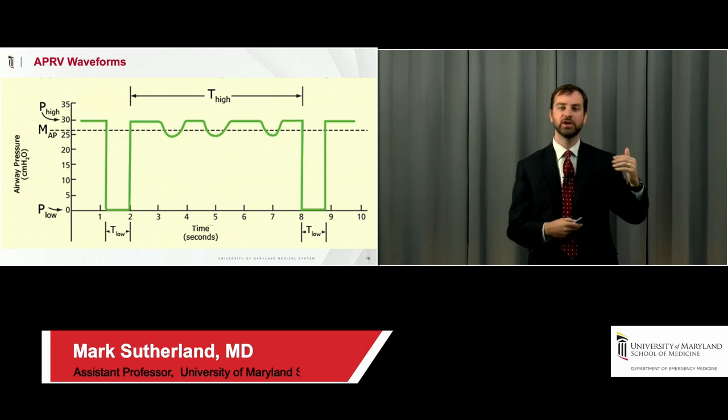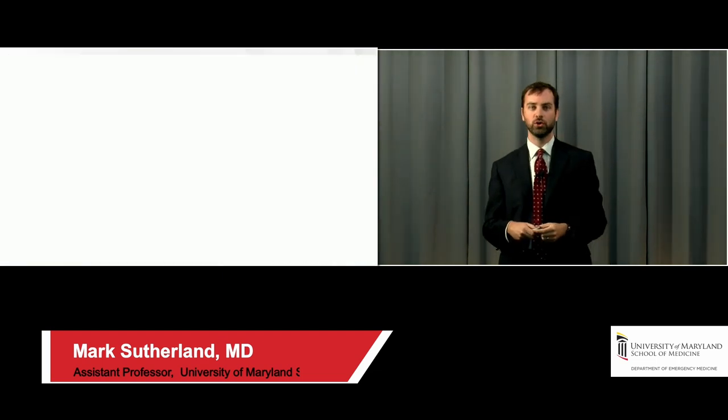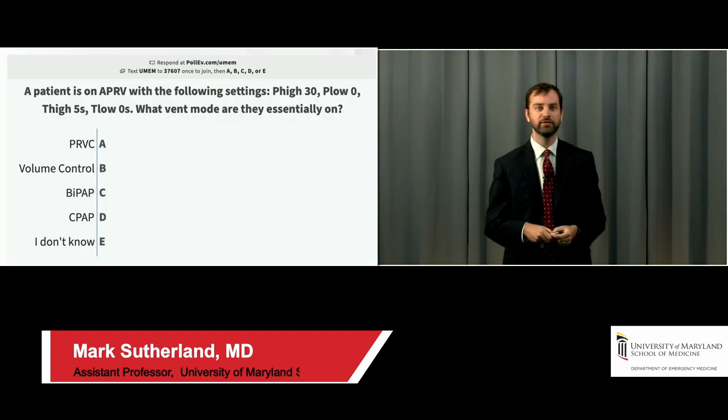Okay? So the patient is, again, doing that with their own effort. That's not the ventilator doing that. On their own, using their own muscles. So I have the following question for you all.